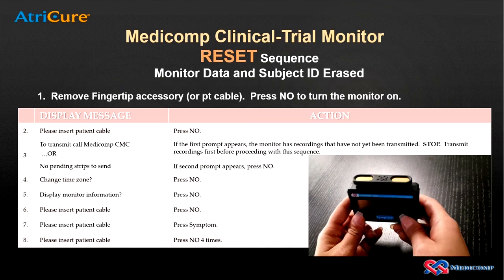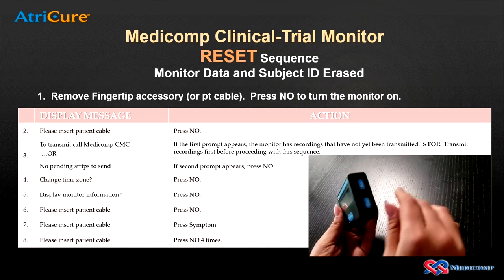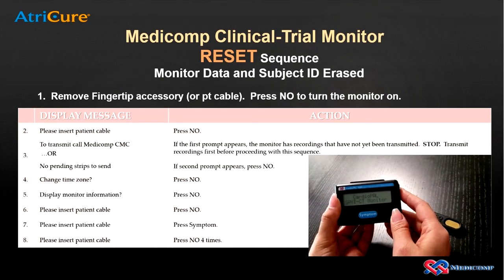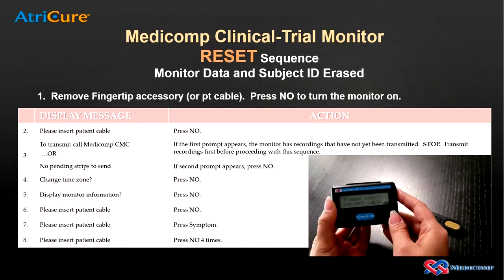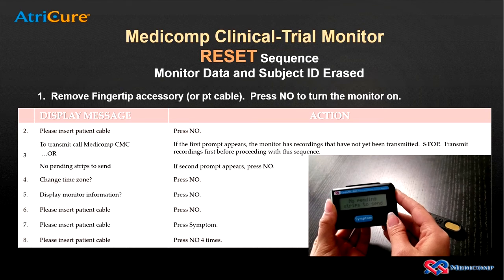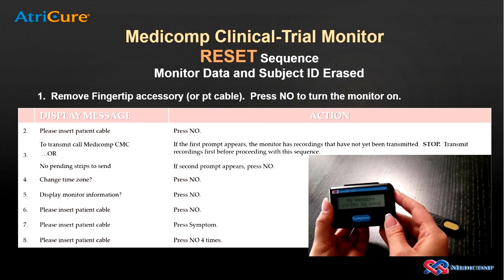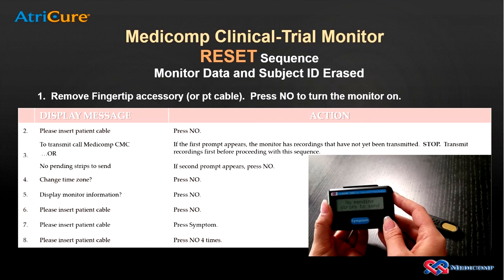Now we'll run through the monitor reset sequence. Remove the fingertip accessory and press the No button to wake the display. The screen should then display, "Please insert patient cable." At this time, press the No button 1 time. If the screen then displays to transmit call Medicomp CMC, it means that there are recordings on the monitor that have not been transmitted. At this point, please stop and transmit the recordings first before proceeding with this sequence.